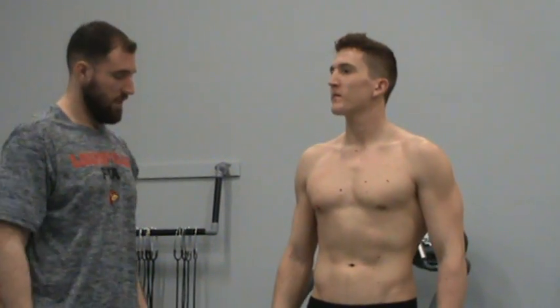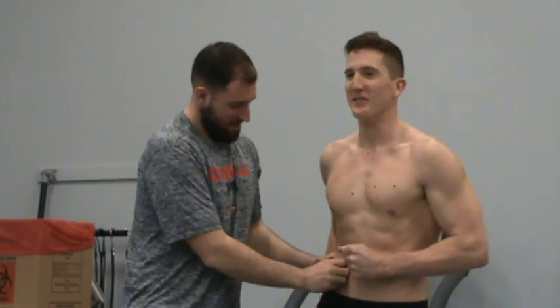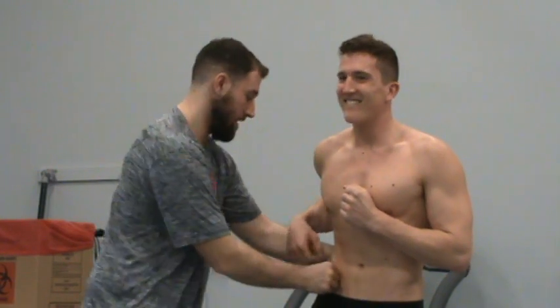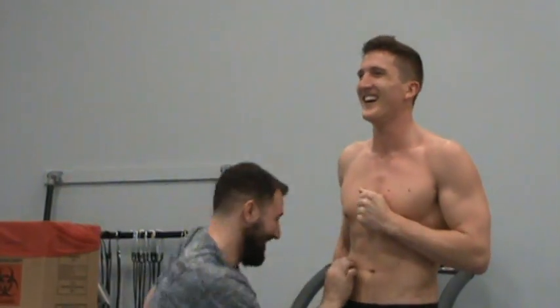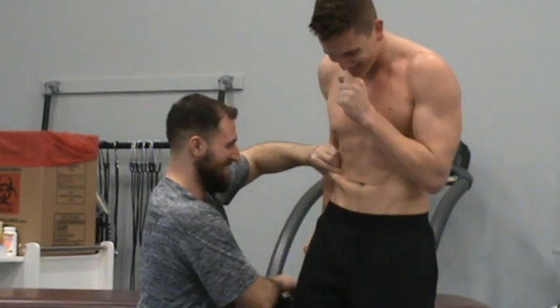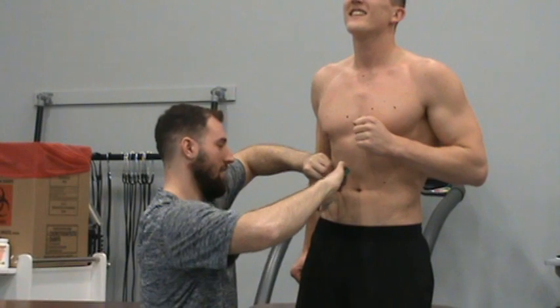Then the suprailiac. I'm feeling for his iliac crest — he's also a ticklish guy and pretty lean, so it's a little hard to find. Once I find that, I go right about here. This is another diagonal fold, so I want the fold to be going diagonal with his muscle. I pull up real quick, place the caliper right under my thumb, and I get an 11.